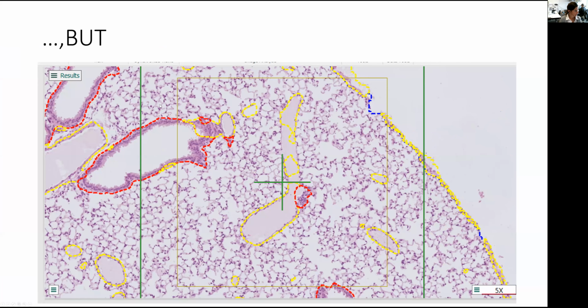So already again, that's the time when I usually need to go in and check how well the software is performing. And that's the same story. Sometimes I can fairly quickly improve things like these by, rather than annotating much more, training longer. That's what works better. And depending on how frequently I have some mistakes, I may sometimes be quicker to just go in and manually correct that before I run the next app.